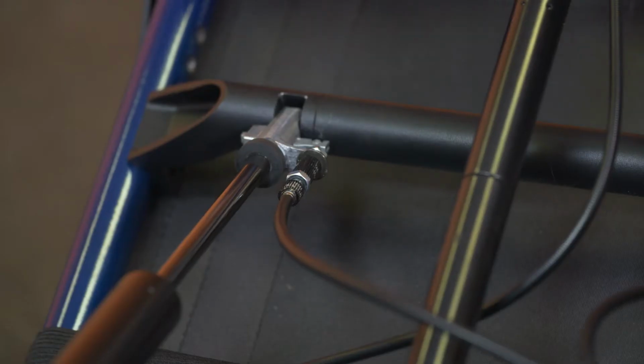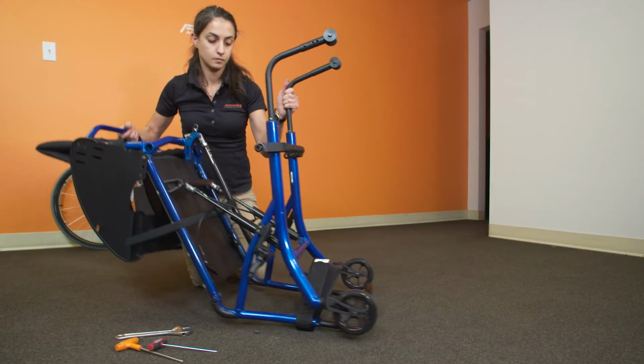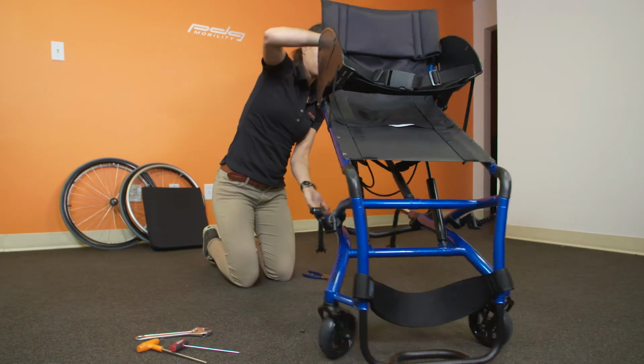As a final note, the gas strut release lever, actuators, and cables must be properly adjusted and maintained for comfortable and safe usage.